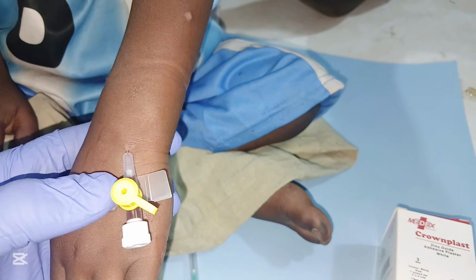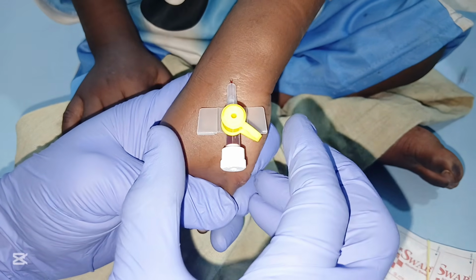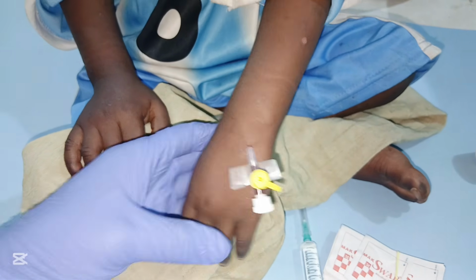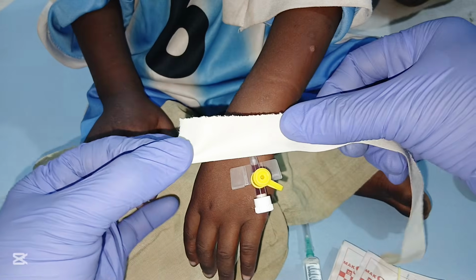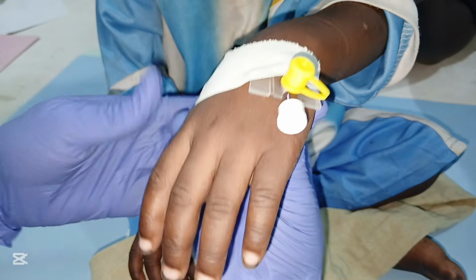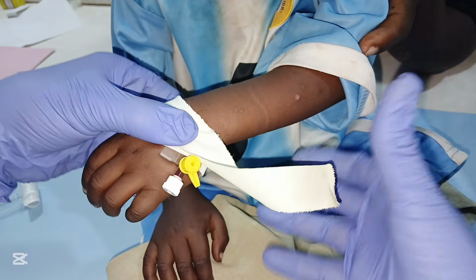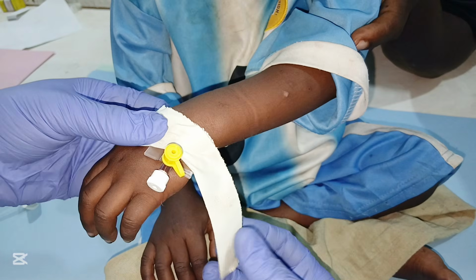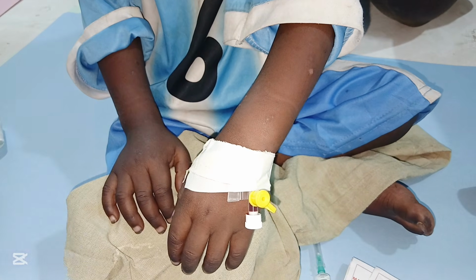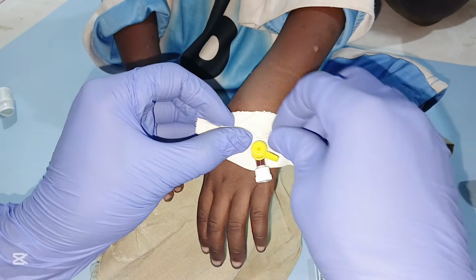Then you start dressing the cannula now. When you finish, make sure you dress and secure the cannula. You get an adhesive tape. Make sure you dress the cannula. So this is how you are going to dress and secure the cannula.